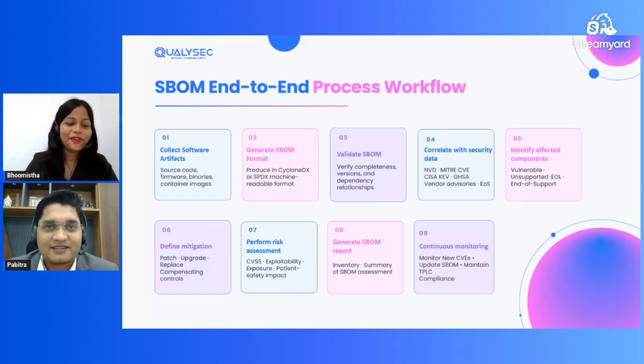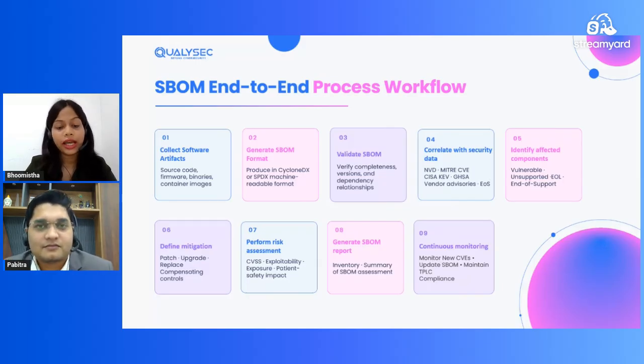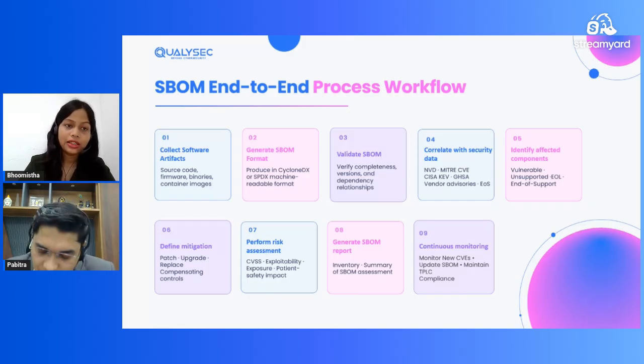That's a very well documented process, sir. I believe when organizations pay attention to each step in the workflow, it not only makes documentation much easier, but it also gives the FDA reviewers a much clearer and more structured view of the submission. It also shows that SBOM implementation isn't a one time activity. Exactly. It's a continued process that supports both regulatory compliance and ongoing cybersecurity.